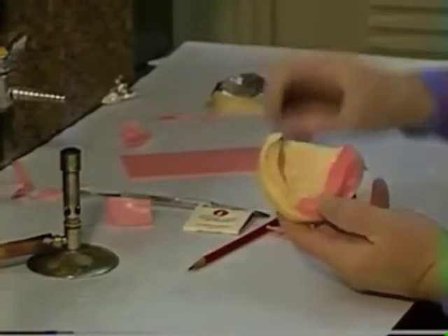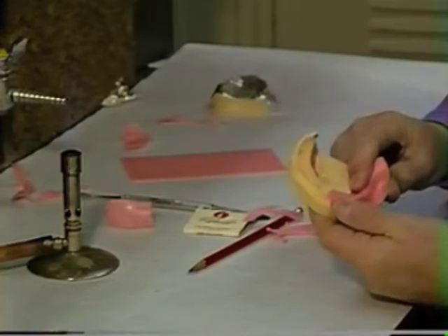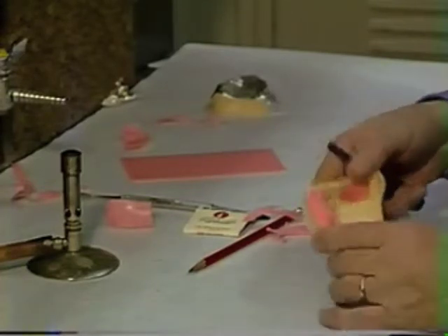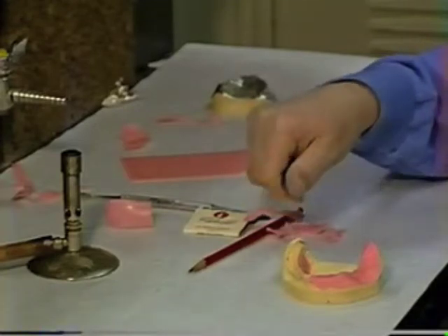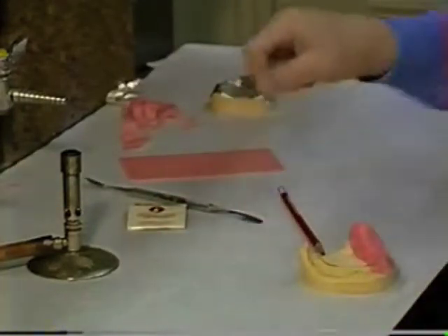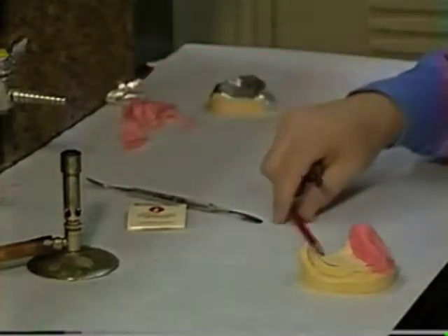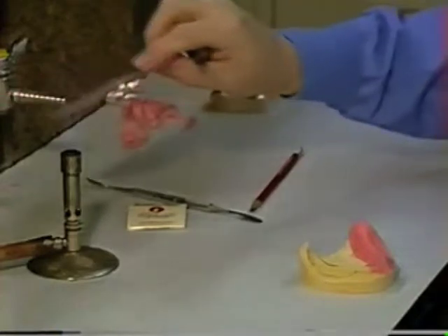And again, like we did on the maxillary, I usually just cut that to the depth of the fold at this point. Then after the tray is made, we can cut the wax back, or cut the tray back to the actual length that we would want the peripheries to go. And we need a wedge of wax now to put relief over the opposite side. So we heat some wax in the flame again.